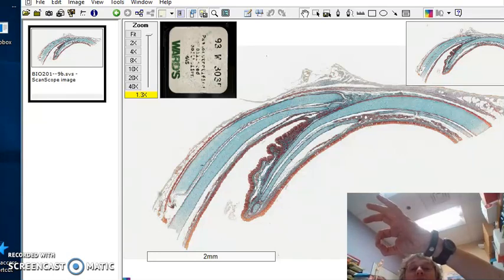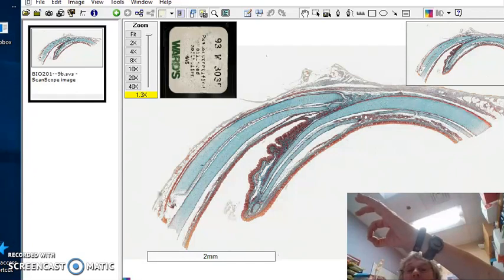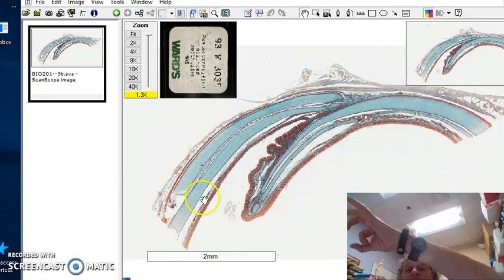So here's a slide of another organ, the trachea. The trachea is the tube that sends air down into the lungs. And in the little inset there, it looks pretty much like my thumb and forefinger. But in this slide, those have slid past each other. And so this gives this configuration that you see on the slide.